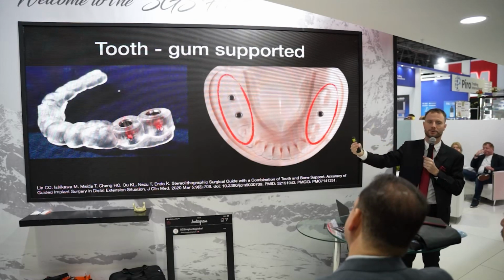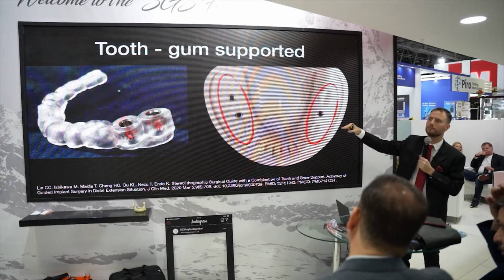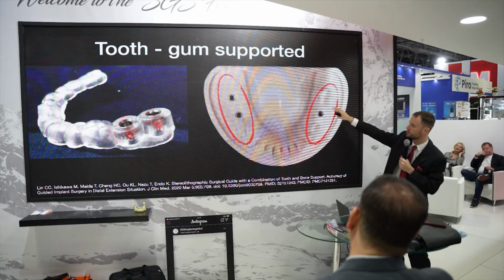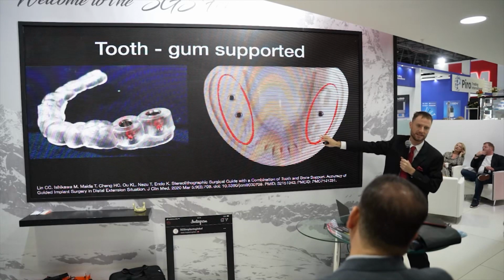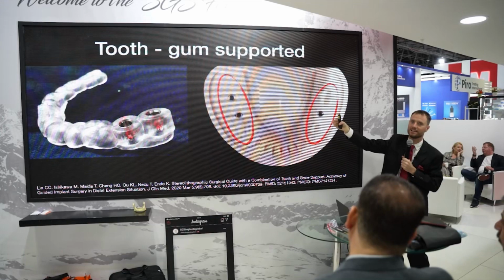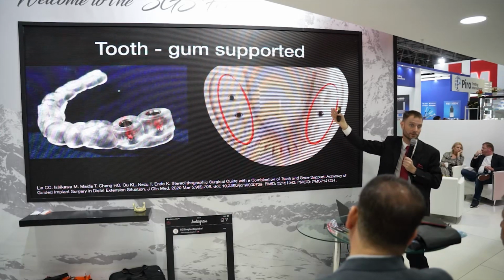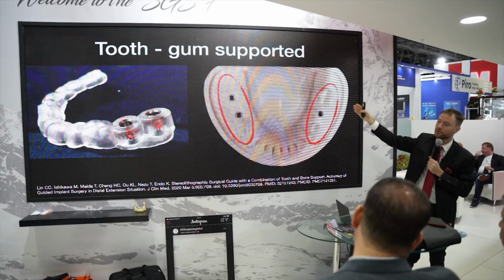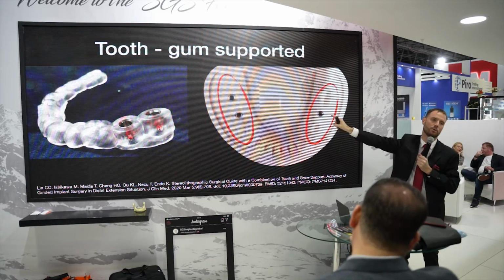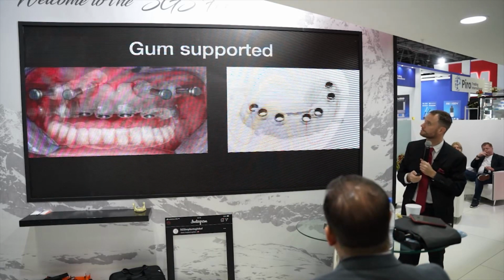That's usually for lateral situations when you have teeth on the mesial side, but distally there are no teeth. So like this case, this side you have one molar tooth here and the premolars. This means this is a tooth supported guide. But that side, distally, you no longer have any anchorage. That's basically a skeletal anchorage. You only have the soft tissue. That's a tooth gum supported combination. There we will have more deviation from your plan than what you have here, obviously.